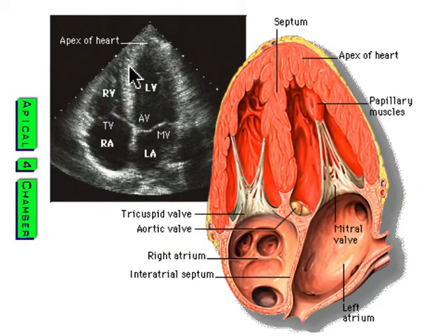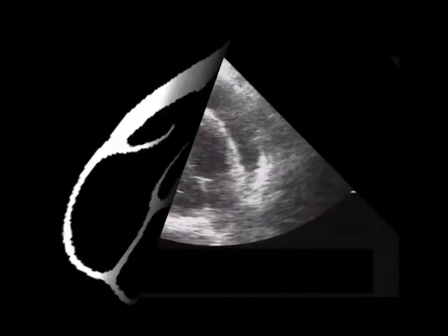The indicator is to the patient's right. We've got the septum of the heart right here. LV, the RV looking nicely 2/3 the size of that LV with the atria below it. This is a schematic view of what's going on in the LV and the RV and the atria with its valves seen there in that apical four chamber.